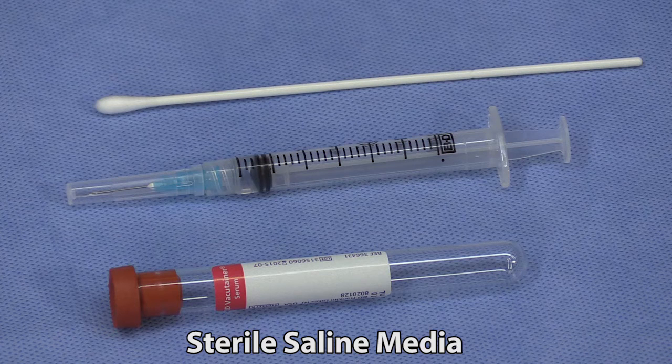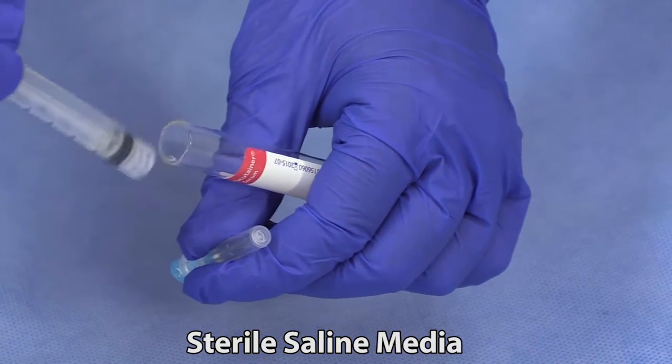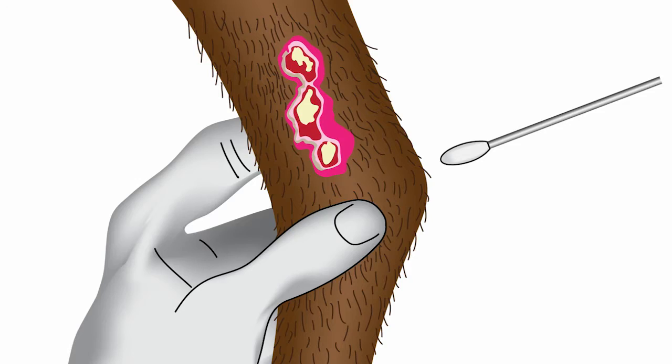Swabs may also be submitted in a sterile red top tube with a quarter to a half a milliliter of sterile saline. This will prevent the swab from drying out while in transit to the laboratory. Swabs that are submitted dry or dry out while being shipped often do not contain any detectable pathogens.